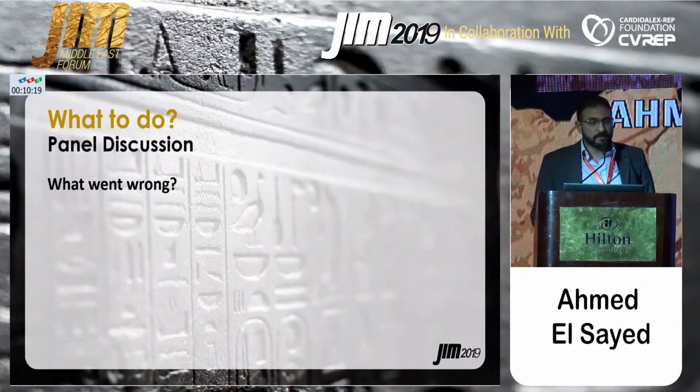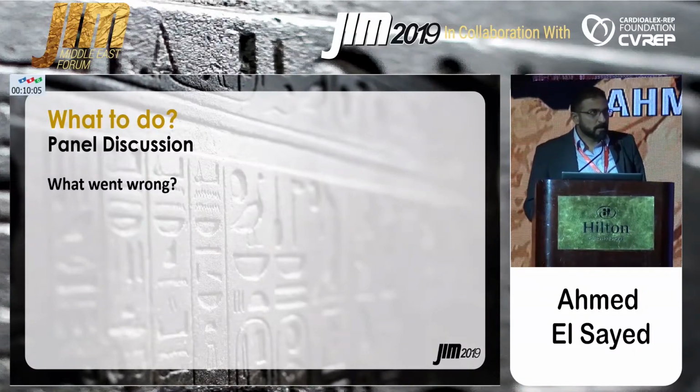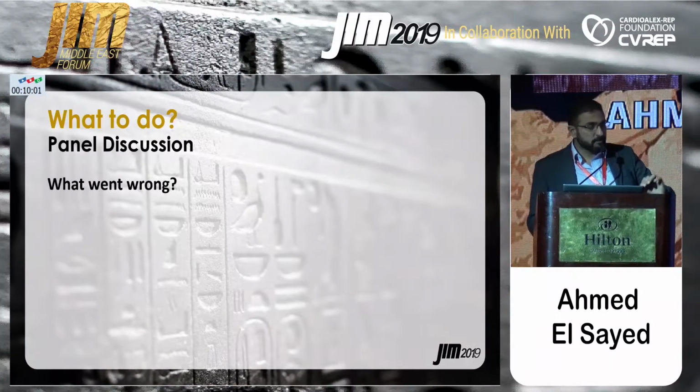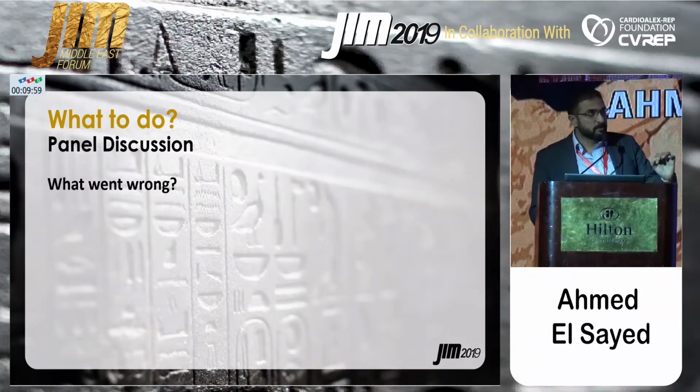So what went wrong? Any suggestions? Yes, he had a VF immediately while trying to cross the valve with the balloon, before even inflating it.